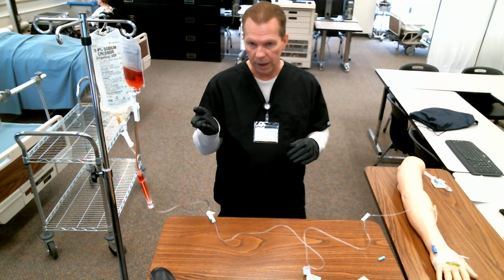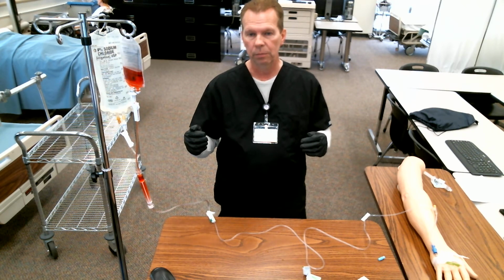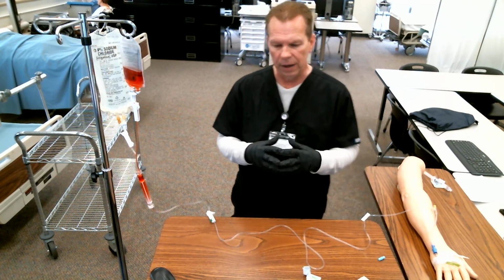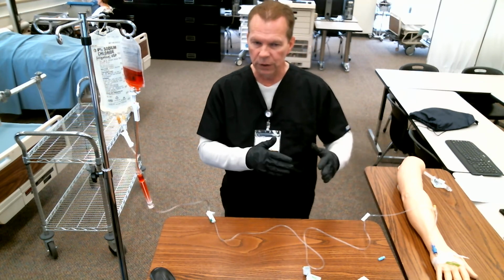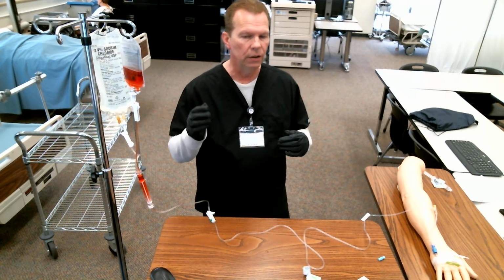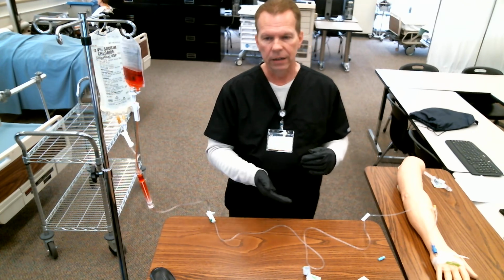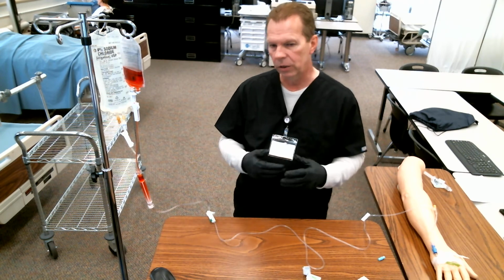I'm going to go ahead and bump up the rate to whatever it needs to be to run in per the doctor's orders, or by a maximum time length of 4 hours. That's what you've got. So periodically while the blood is running, after that first 15 minutes and everything is good, I can leave the room and go take care of my other patients, but you're just going to come back periodically, depending on the hospital's policies, and recheck those vital signs, check on your patient, and make sure everything's going good while the blood is running.